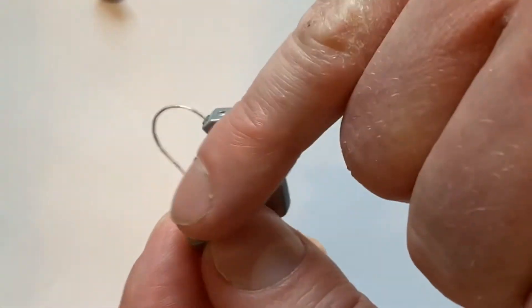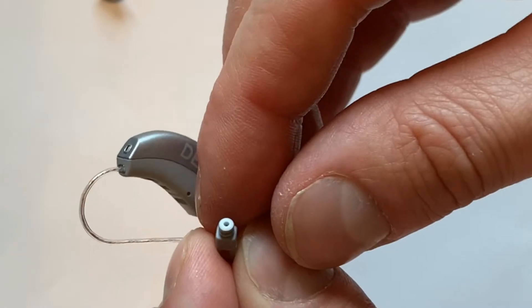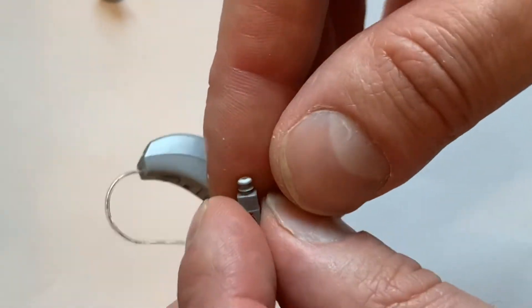And then once you've removed that, you've exposed the filter that's sitting right here in the end. That's what's called a Ceruse Stop WaxGuard.